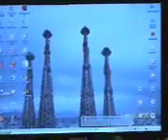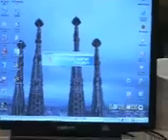Okay. So then what you'll do is you'll go to the Vitabase icon, double click that. Vitascore comes up. And then watch this one too, Jack. So then what you want to do is hold down the right button here till you see CN. CN will turn on. So now it's ready for connection. If you wait too long, the CN will turn off on you.